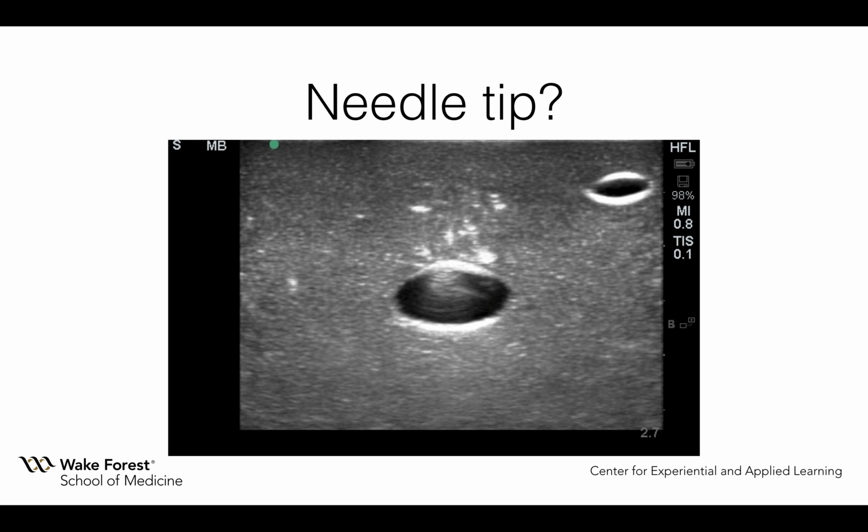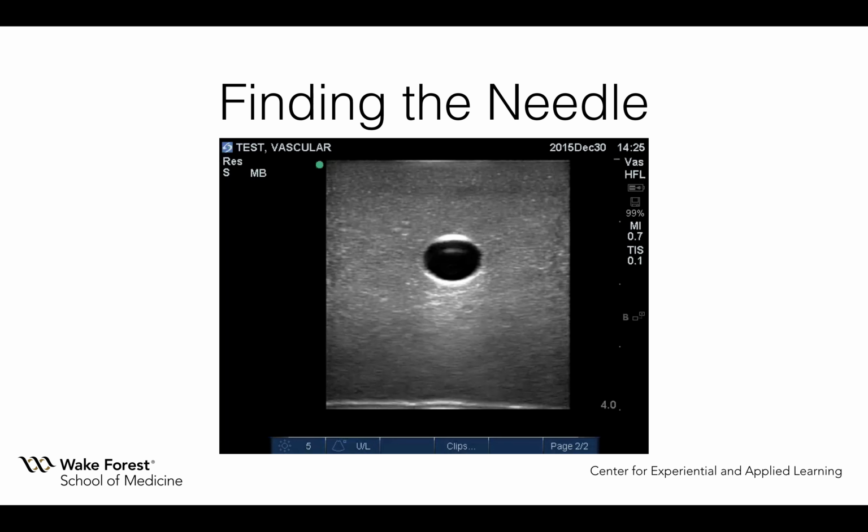Needle tips can be hard to find, especially in actual human tissue. Here we're looking at an image of a phantom, and you can see there are lots of other hyperechoic or bright white dots over the blood vessel. It would take a little bit of searching to make sure which of those was our actual needle tip if we were performing the procedure.